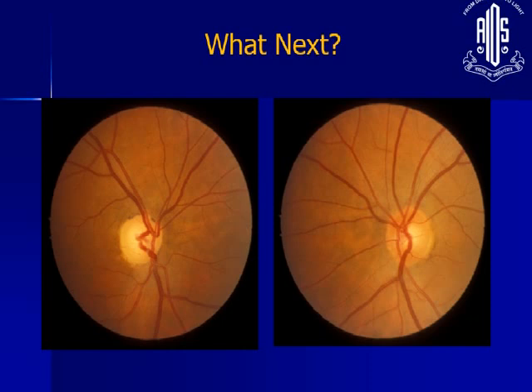The two important things: if the patient is in a presbyopic age group, then he must be wearing his full refractive correction. There should be enough illumination on the plates. Now, what if the patient says that he is not able to read the first plate? You see in an Ishihara chart, the first plate is 12. The patient says, oh, I cannot see even this. His vision is 6/6, whatever, yet he is not able to see it. What is your interpretation? Yes, the first plate is also called a test plate.